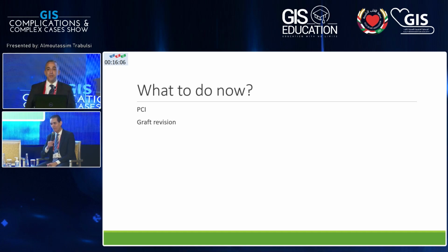Because the LAD is miserable from the beginning, I don't want to put my colleague in the same situation again. I've seen a clip, almost a clip in the LAD. Maybe he has something. If you see the echo he showed, the RV is severely impaired. So I wouldn't be happy to send him to the surgeon because of this alone. He will not get off bypass.